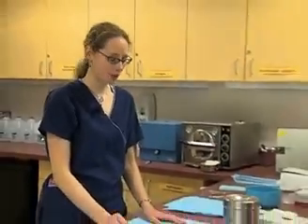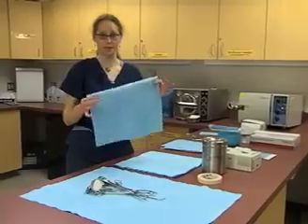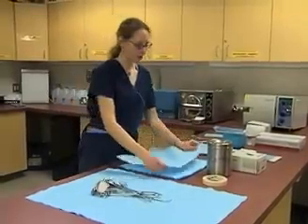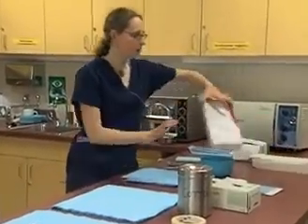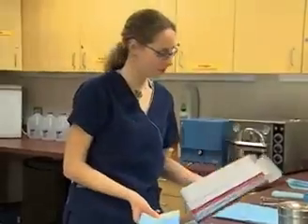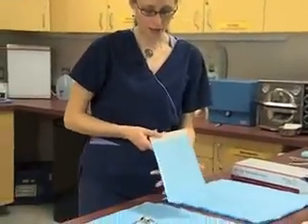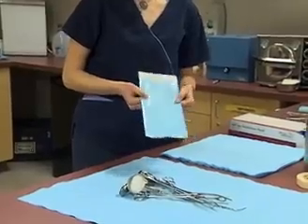Once we have our surgical tools ready, the other supplies we're going to need is autoclave paper. A lot of times it's just this blue paper — sometimes people refer to it as CSR. Other things that some offices prefer are pouches, which come in a variety of sizes. They're very handy to use, and as you'll see later when we do wrapping, this is a lot easier option, though they are a little bit more expensive.